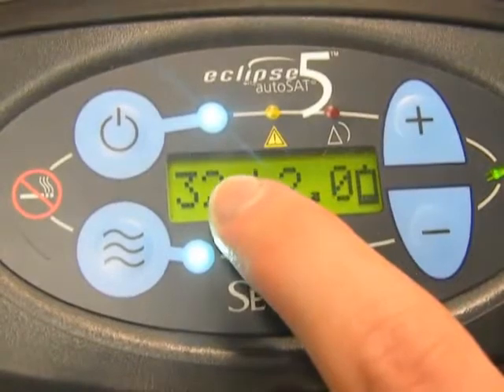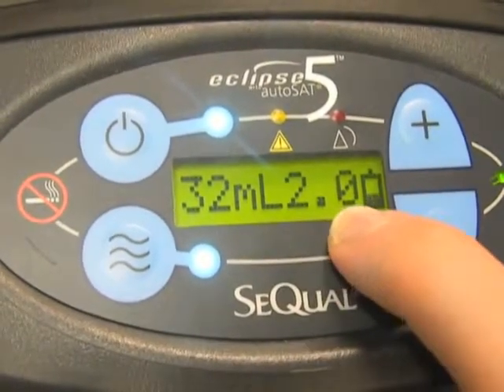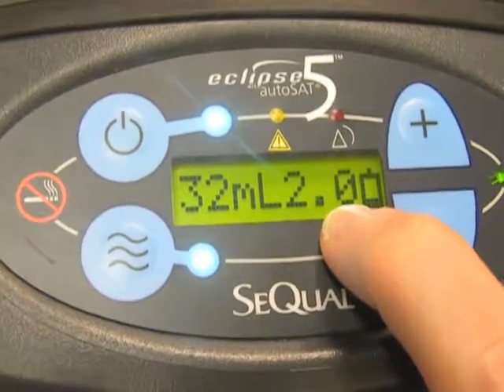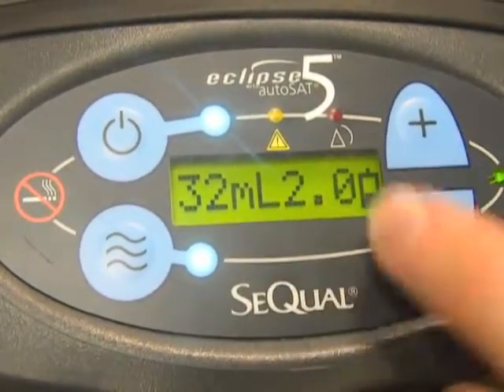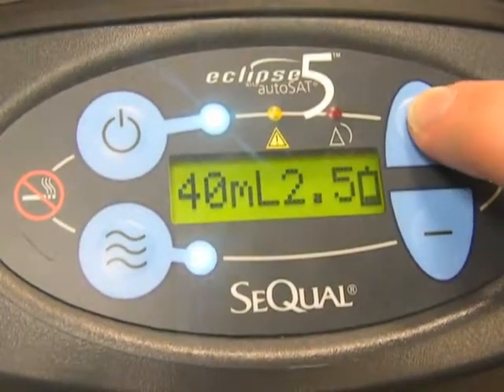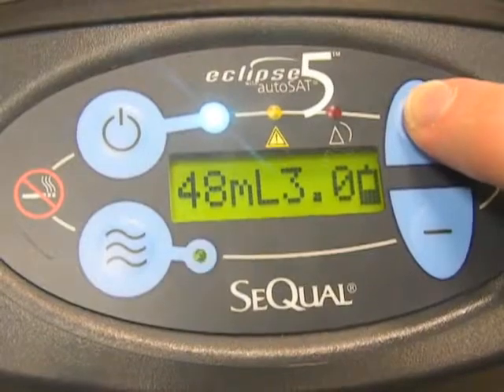Again, note your display says 32 milliliters 2.0. This 2.0 is not a liter per minute equivalent, it's just the setting number. Your actual dosage is the 32 milliliters. There are 9 pulse settings on the Eclipse, going from 16 milliliters all the way up to 192.